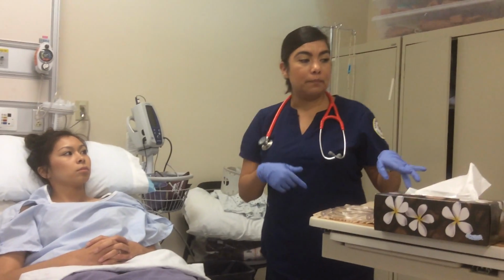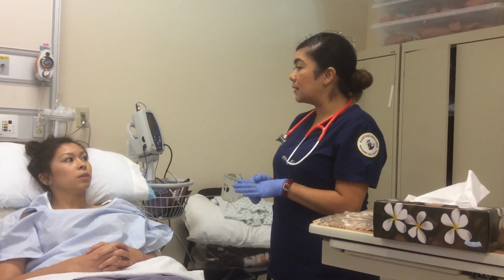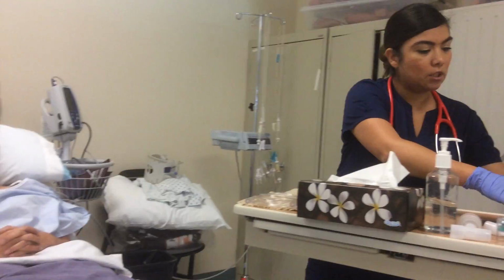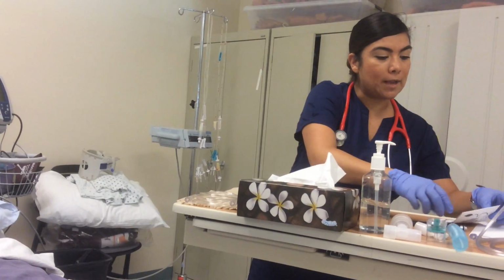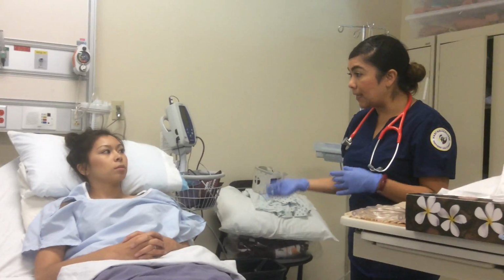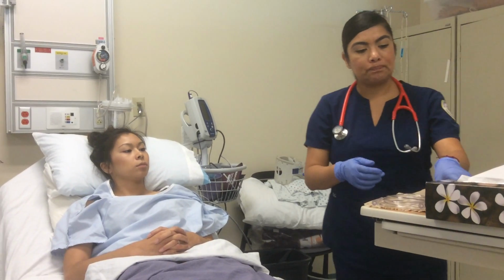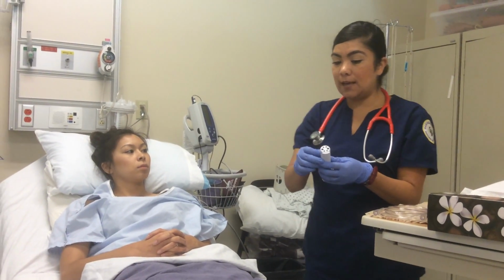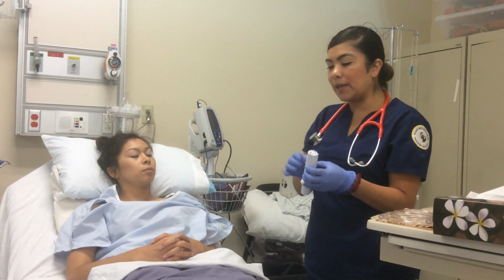Based off of, can I get your height, please? 5'4". Okay, and then your age? 24. Okay, perfect. So I'm just going to check right here. Okay, so based off of your height and your age, there's a goal. And it looks like your goal is at the 418, okay?